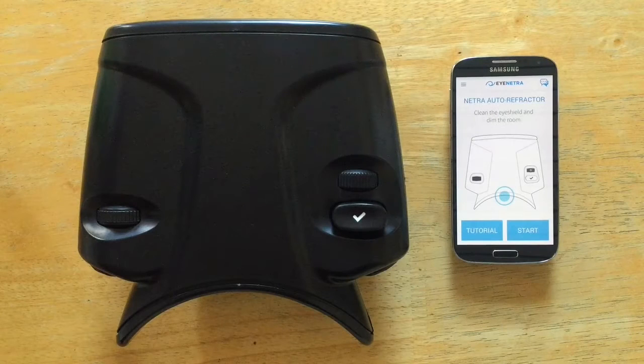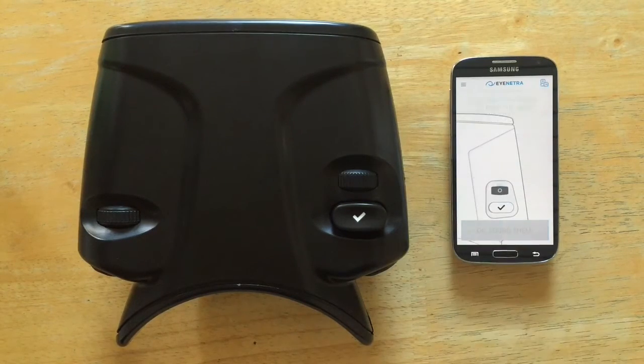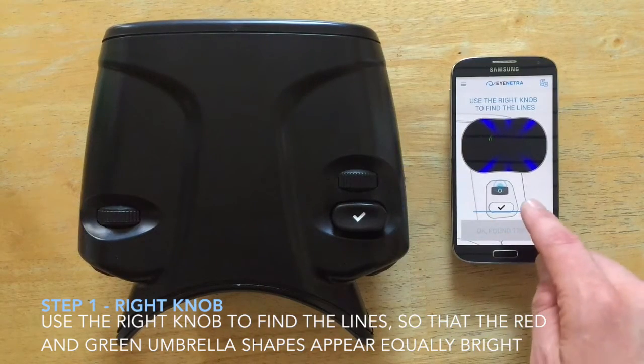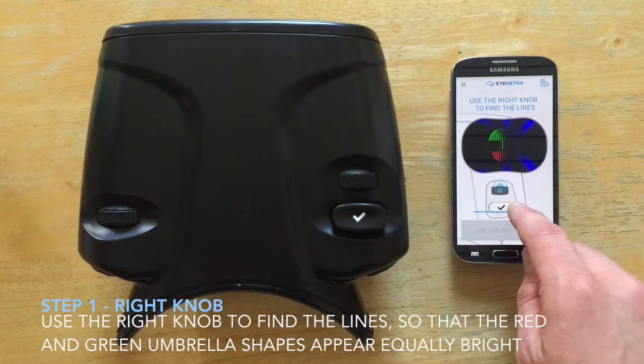Now let's briefly review the device controls. Patients using the iNetra autorefractor will repeat three simple steps in order to arrive at a measurement. First, they will use the right knob to find the lines so that the red and green umbrella shapes appear equally bright.